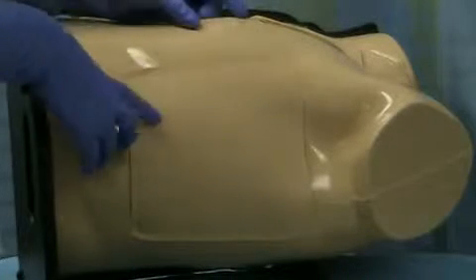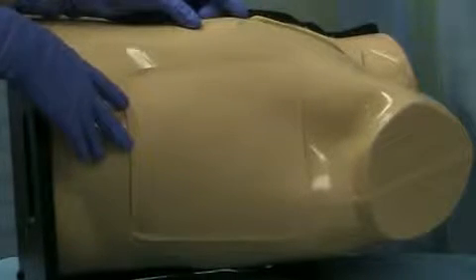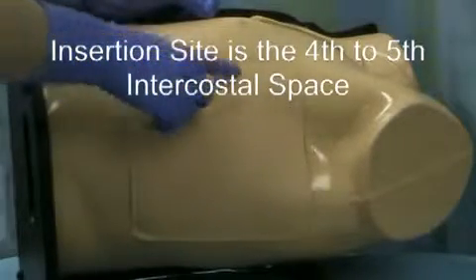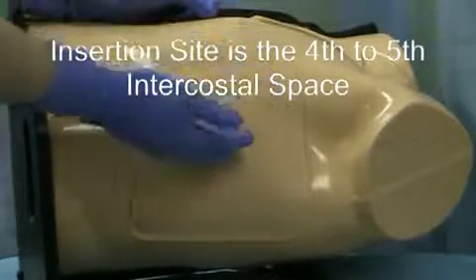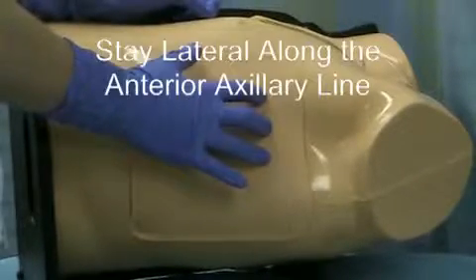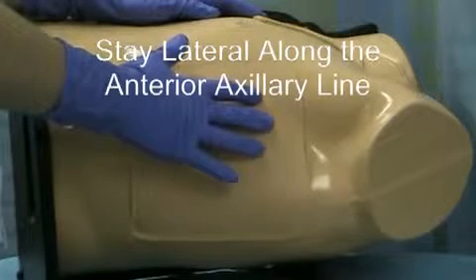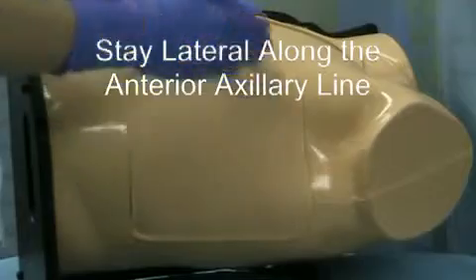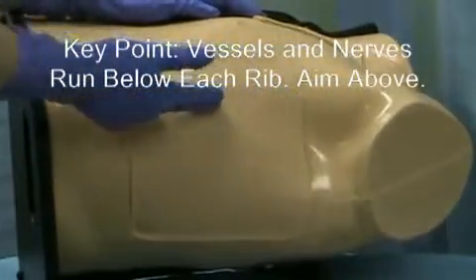That means that we have a very specific area in which we're able to place a chest tube that will keep all these structures safe and then still treat our patient's abnormality. We like to place a chest tube somewhere between the 4th and 5th intercostal space, which on a male patient generally coincides with in line with their nipple. However, obviously in female patients you can't use this anatomic landmark because it won't be in the same place. And we also try to do it somewhat lateral so that we're usually about in the anterior axillary line.